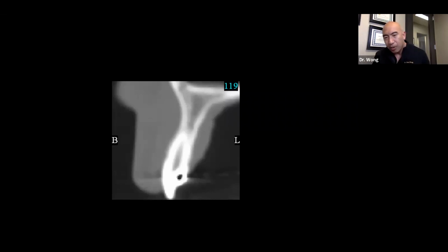The ridge apical to that canine root is only about 5 millimeters in diameter from buccal to lingual. So it's only about 5 millimeters wide, and that's all you're going to preserve, minus 20%. So you're going to come back in 12 weeks to a ridge that's about 4 millimeters wide, and you're going to be like, well, that socket grafting technique didn't work, or that bone graft material didn't work. And you'd be wrong on both accounts.